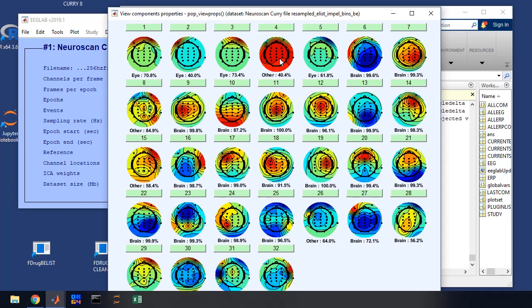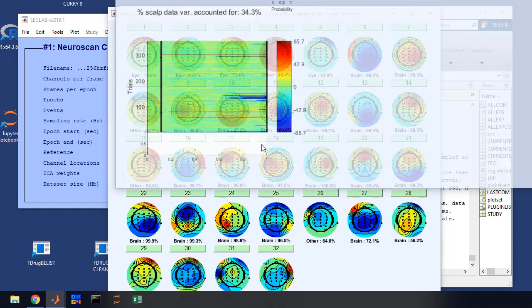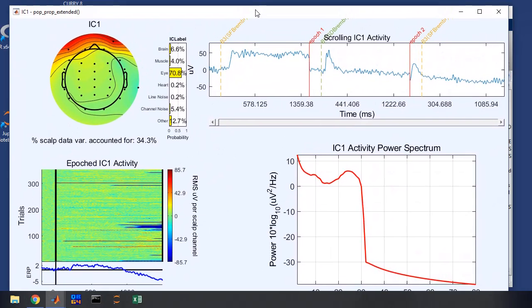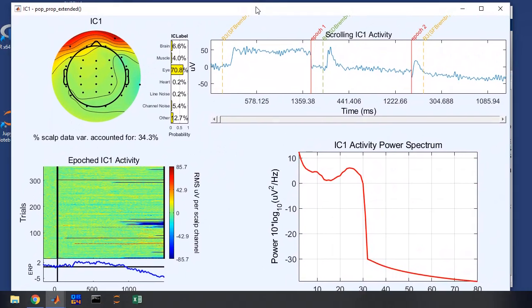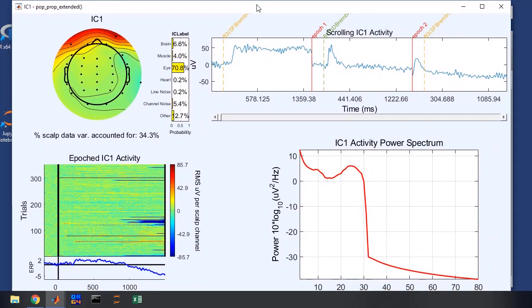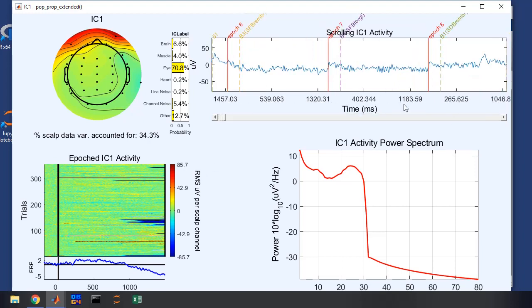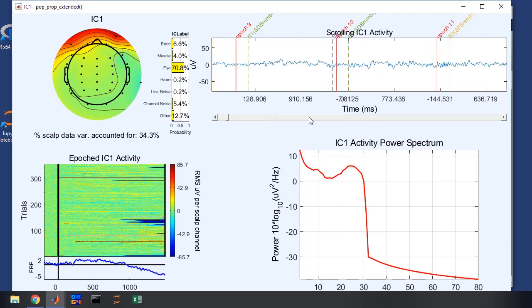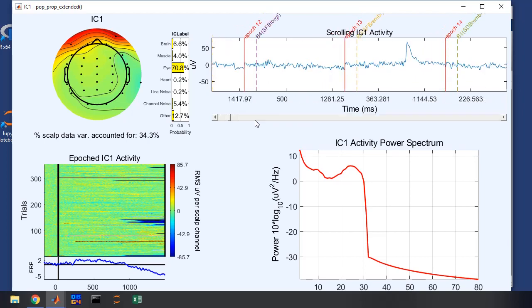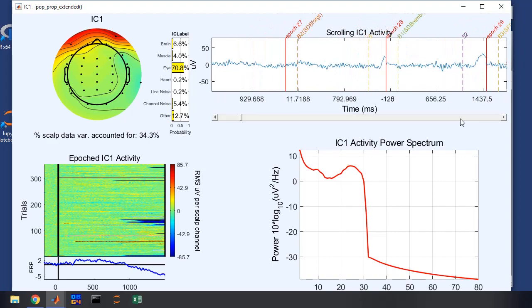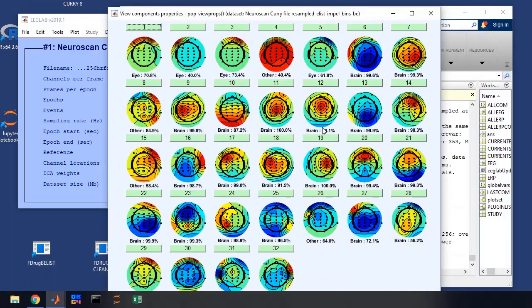So we're going to go through and look at some of these components. I'll just click on the first one. And there's some examples in your protocol, as well as you practice labeling. So hopefully we'll get some experience with this. But we can see here that the activity is coming from mostly the ocular channels. And you can get a scrolling activity here and see that that looks like classic ocular activity here, for example, and down here. So that's a pretty clear ocular activity.